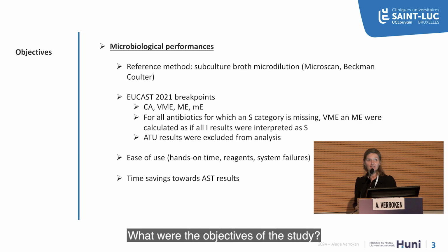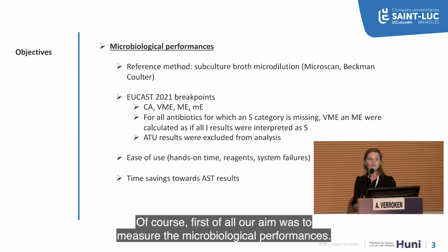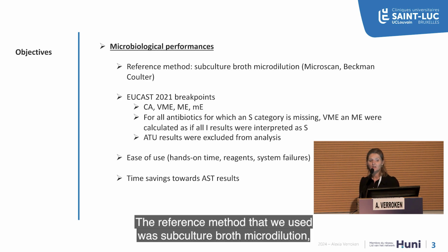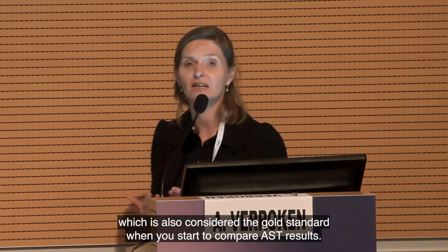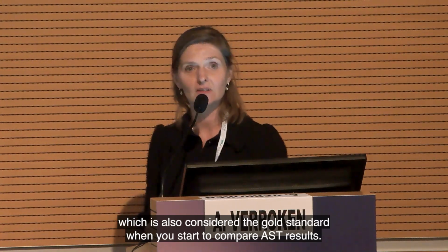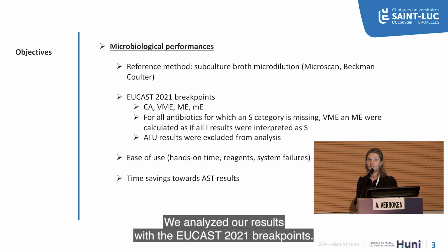So what were the objectives of this study? Of course, first of all, our aim was to measure the microbiological performances. The reference method that we used was subculture broth microdilution, which is also considered the gold standard when you start to compare AST results. We analyzed all results with the EUCAST 2021 breakpoints.